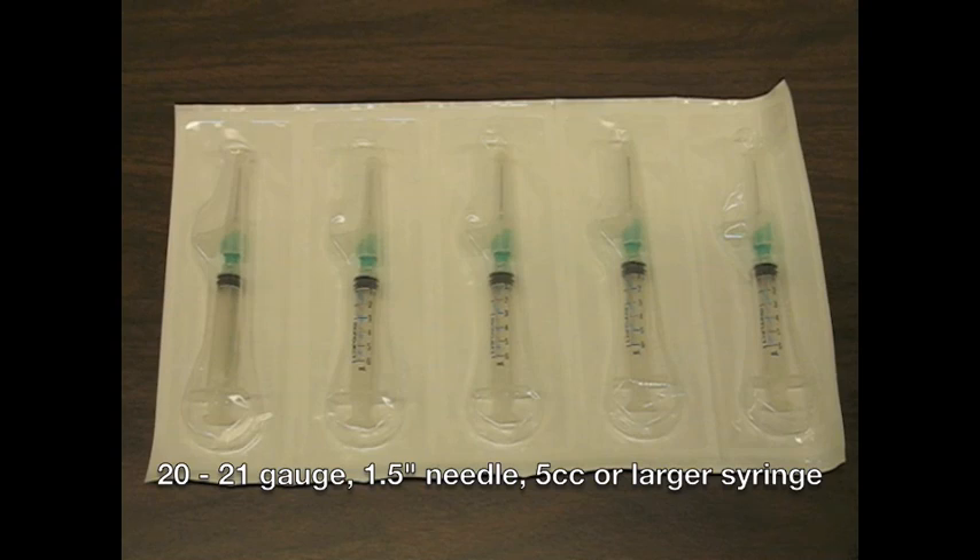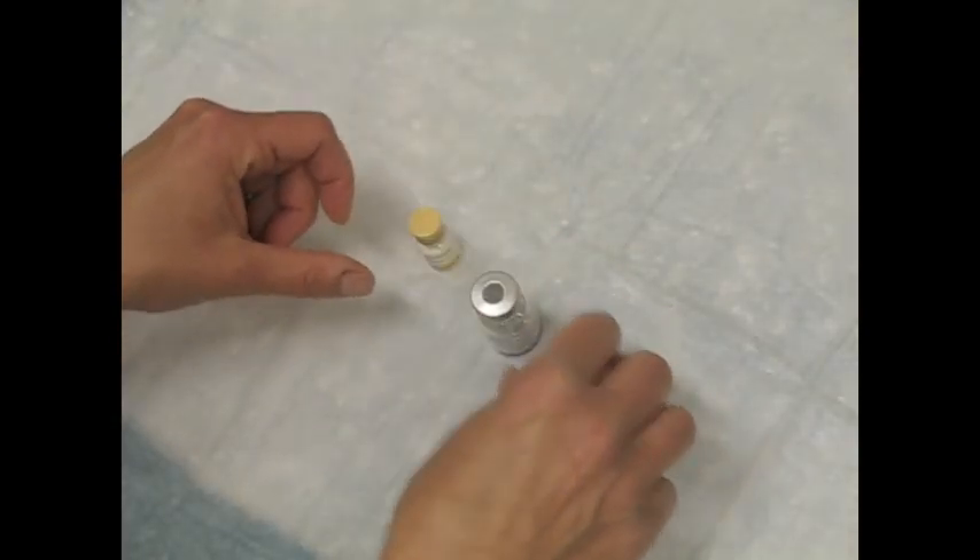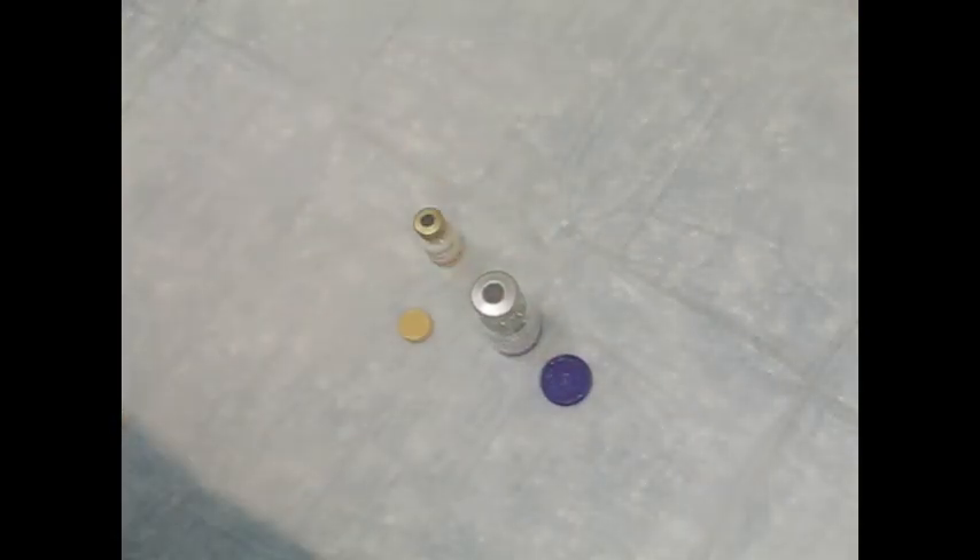For reconstitution, use a 20 to 21 gauge, one and a half inch needle with a 5cc or larger syringe. There are 2.5 milliliters of adjuvant in a 3 milliliter vial, and there are 2.5 milliliters of antigen in a 10 milliliter vial.